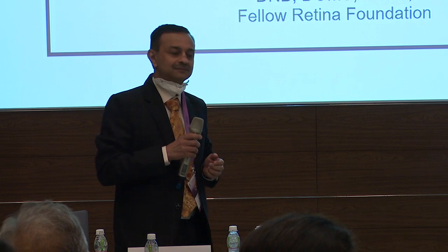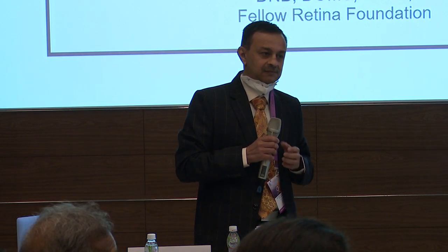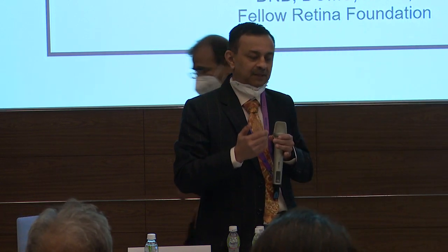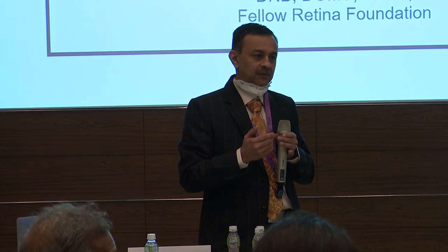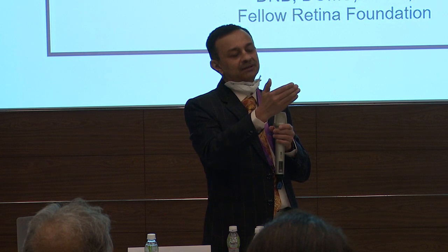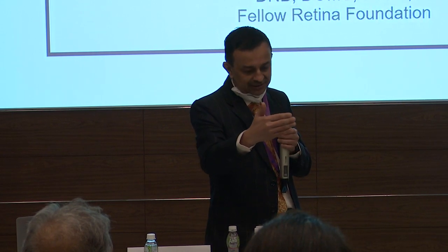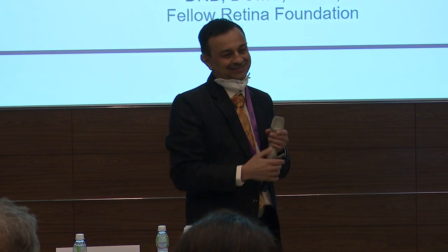Can those larger bullae in VKH be secondary to stromal infiltrations? Because it's a two-dimensional en face kind of photography. No, the thing is, this impression that the RPE is being involved needs to be verified. Basically, this technology picks up the RPE level only. It doesn't go deeper. It is the reflection from behind which is highlighting the RPE more. That is why it is called retro mode.